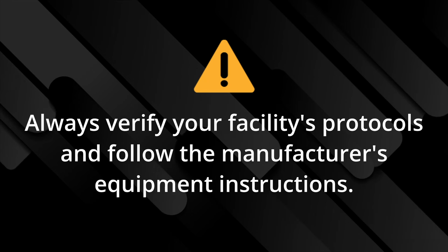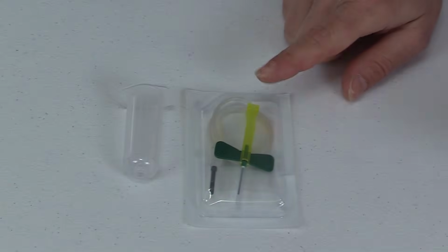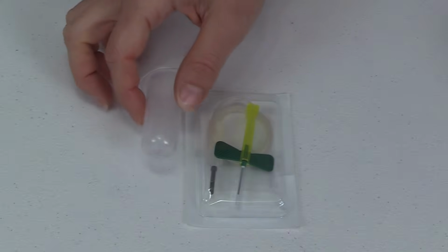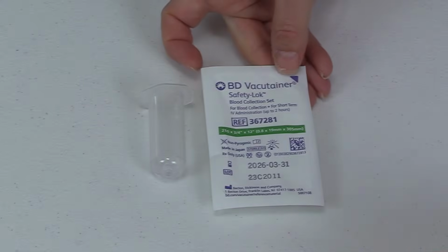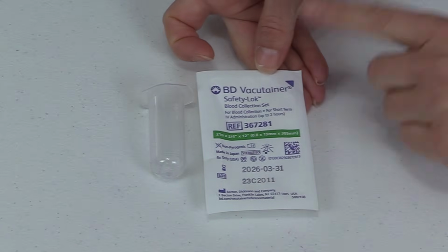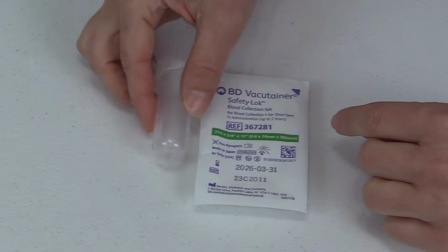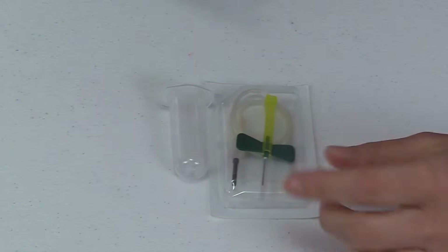And whatever you use, you want to be familiar with your equipment. So let me quickly go over what I have here. Here I'm going to be using the winged butterfly, which you can tell by its appearance with its little wings. And I'm going to get any accessory that I need to use with this. On your packaging, you always want to get familiar with your equipment because you can use different stuff to draw blood. On the packaging, it tells me what I'm using, what it's used for, the size, and the expiration date. And here, I'm going to be using a Vacutainer tube holder that will actually screw onto this, and you can see that here in a moment.